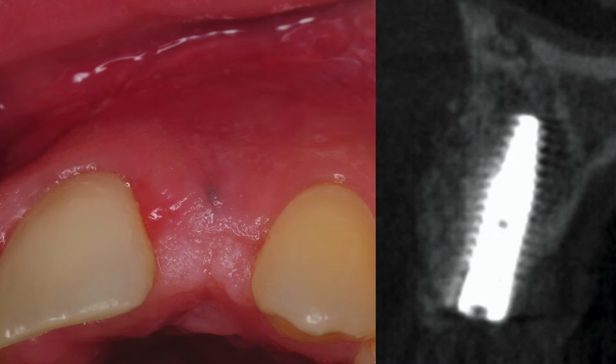Long term, second round for her. Remember, she had a failed implant. So we want this to work long term. Let this implant integrate, we come back. You can never have enough soft tissue. Never enough soft tissue.